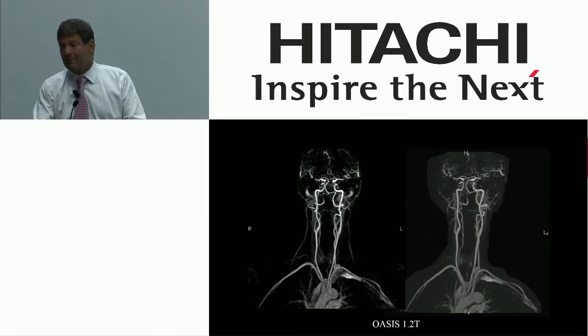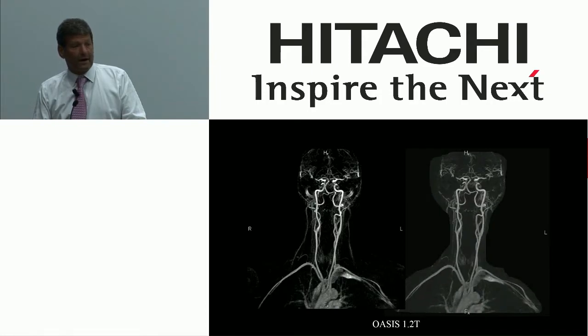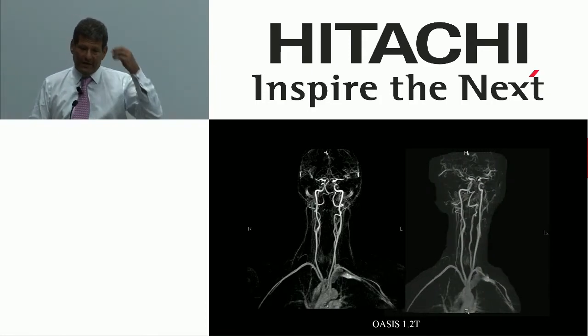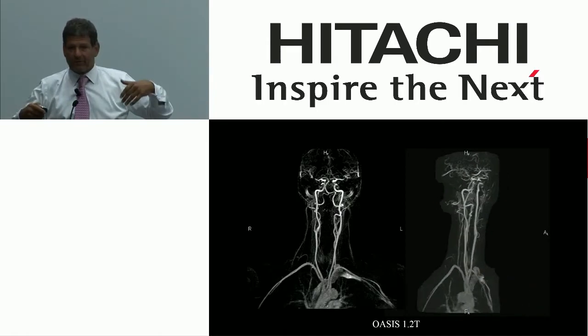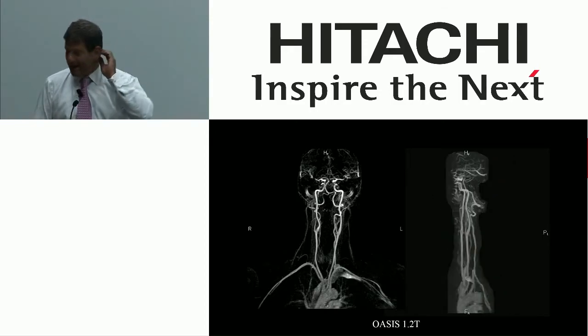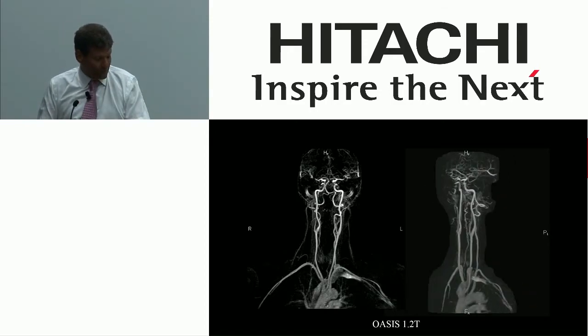Now, these, by the way, come from multiple facilities around our network. I have them all feeding in because when I roll a new scanner out, I validate the image quality. So I'm getting cases coming from the West Coast, from the East Coast, from North, from South. They're all feeding in, and I get to cherry pick and bring things to show you.